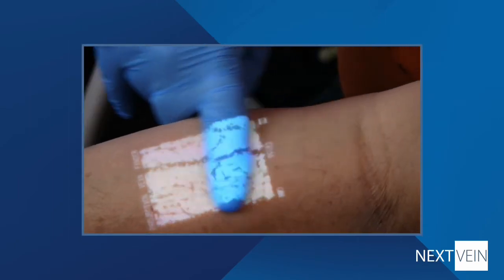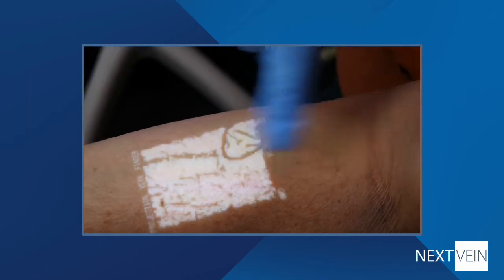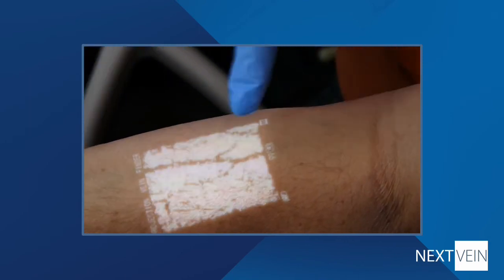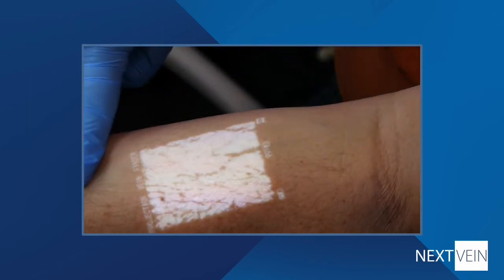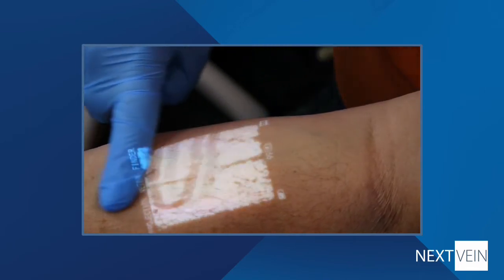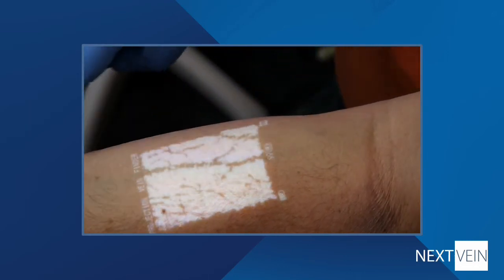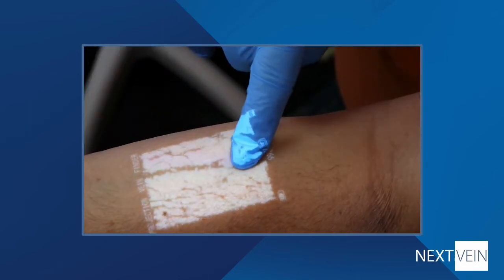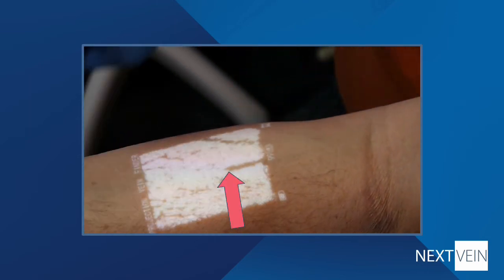All veins have valves that keep venous blood flowing back to the heart. It's helpful to avoid valves when cannulating, as puncturing the valve might be painful and having the end of the catheter rest against the valve might interfere with the IV or blood draw. In addition to patency, the wipe technique can help locate valves. When you wipe past a valve, only the vein segment below the valve will disappear. You can infer the location of the valve by the appearance of the wiped vein, as shown here. Once you've selected and verified the vein, continue with the venipuncture following your facility's standard procedures.